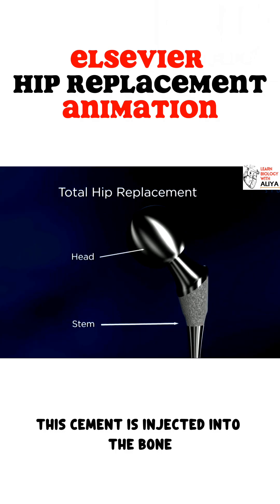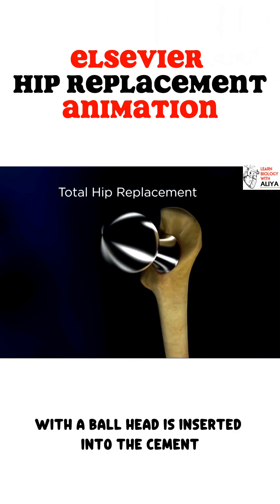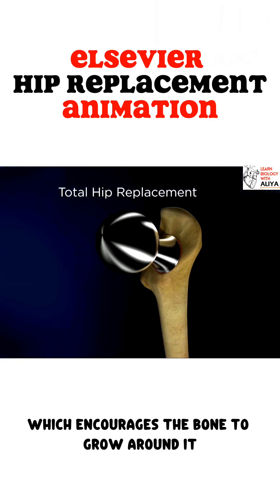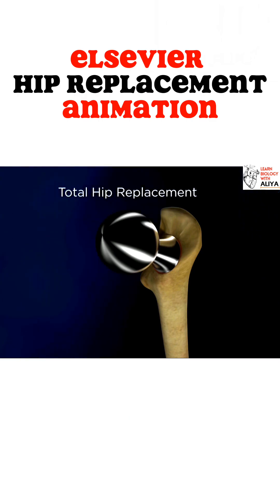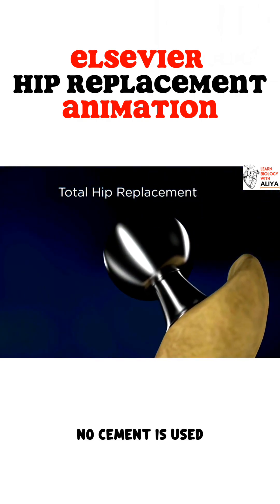This cement is injected into the bone and a metal stem with a ball head is inserted into the cement. Or we may use an implant that has a special coating, which encourages the bone to grow around it. This type of implant is securely pressed into the femur. No cement is used.